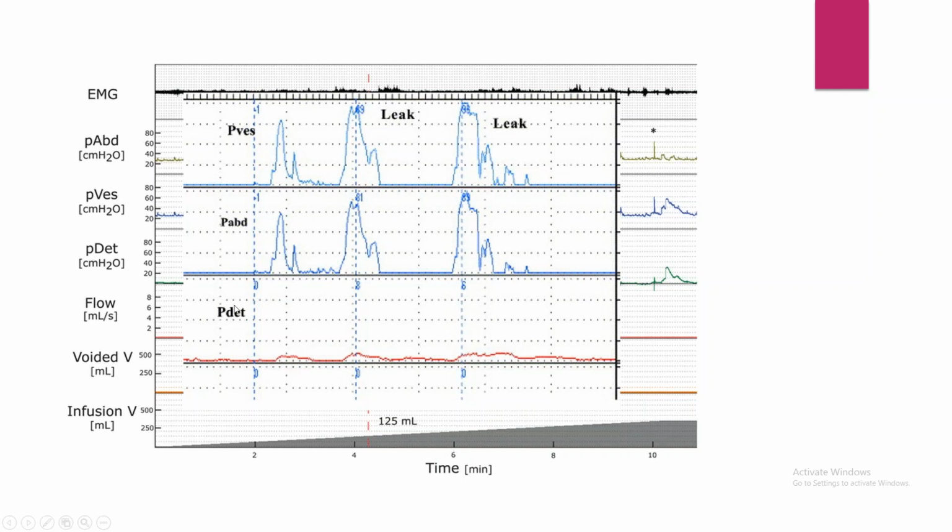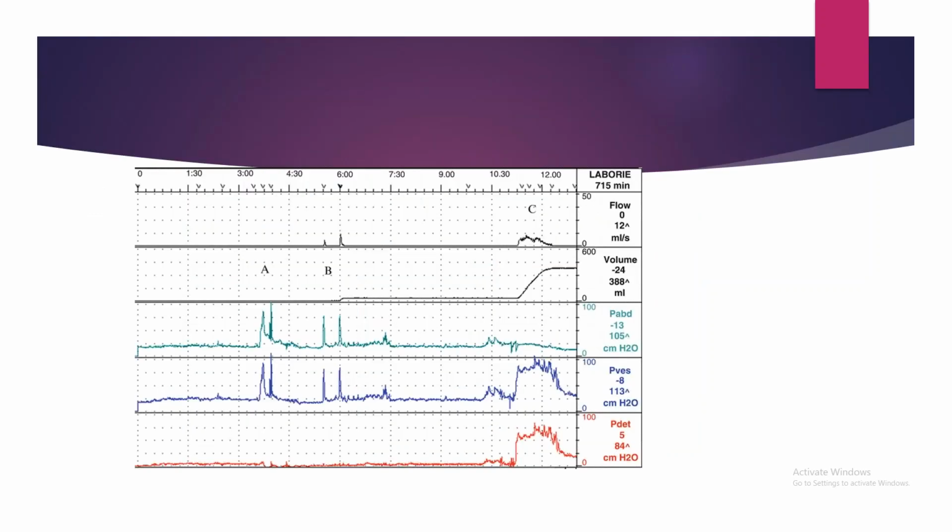See, this is the flow. Can you see this? There is a leak, there is a leak, there is a leak. Three leaks are there. Got it? So diagnosis? Stress incontinence, ma'am. Urodynamic stress incontinence. Yes, urodynamic SUI.